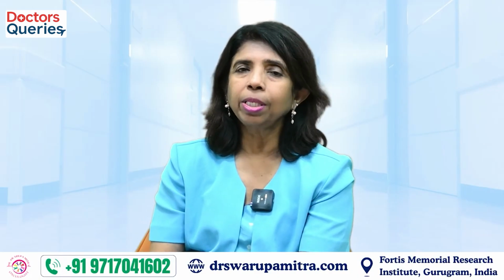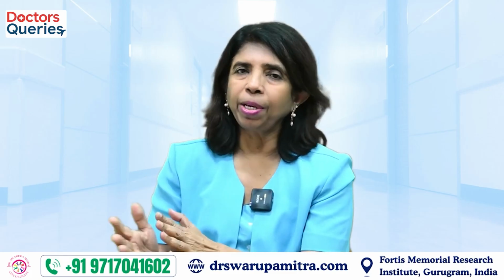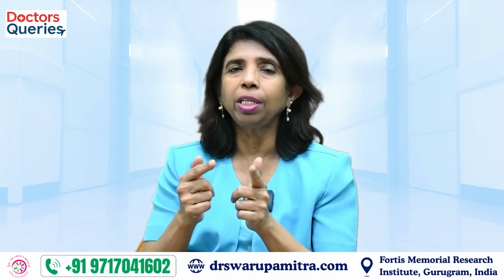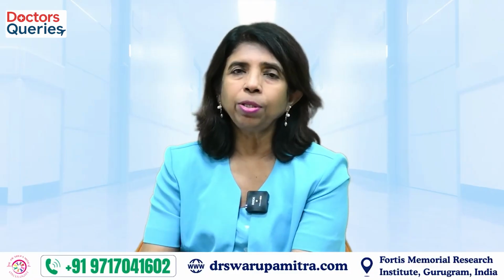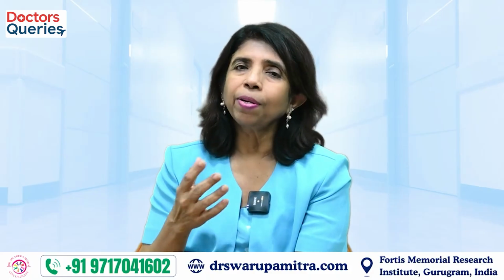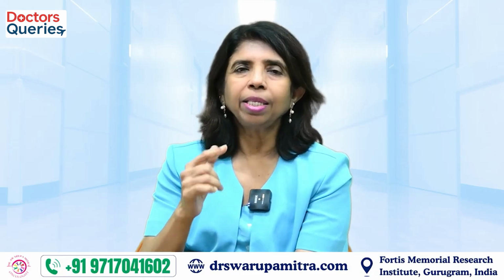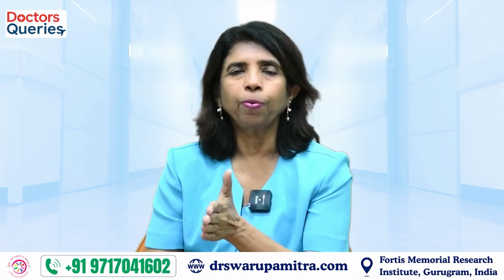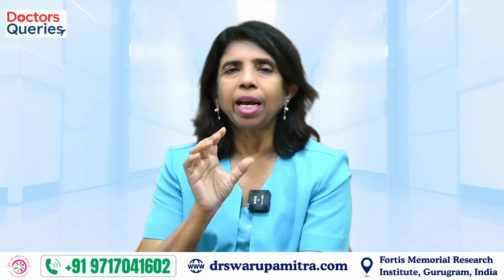So the patient comes after 2 to 3 days, and this is the fourth step of the treatment, where the patient is called to the OPD, and before beginning the treatment we counsel the patient once again about how the treatment is going to run. We explain to the patient once again how the patient will feel on the treatment table and what kind of toxicities or side effects the patient can expect, and then the treatment is begun. Once the treatment is on, this may be for about 3 weeks, 4 weeks, 5 weeks, depending on the plan which has been made for the patient and the site which has to be treated.